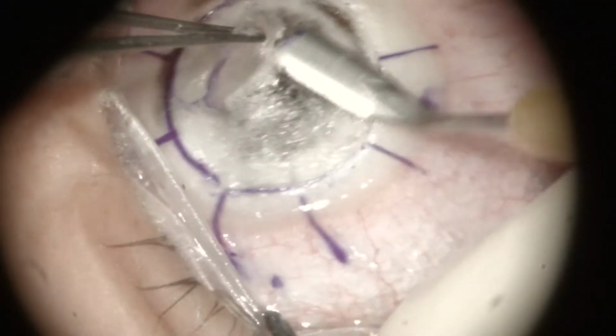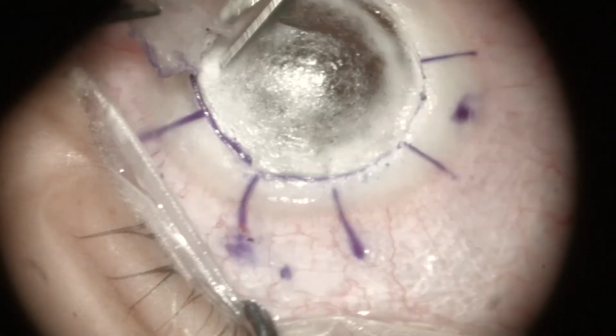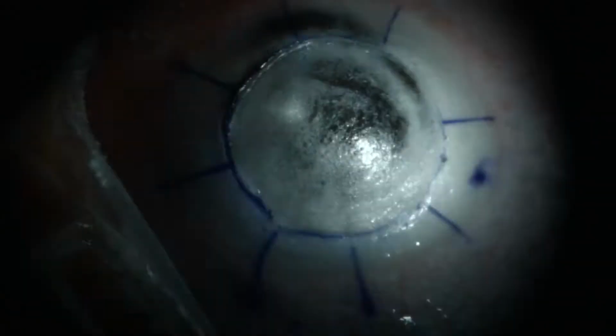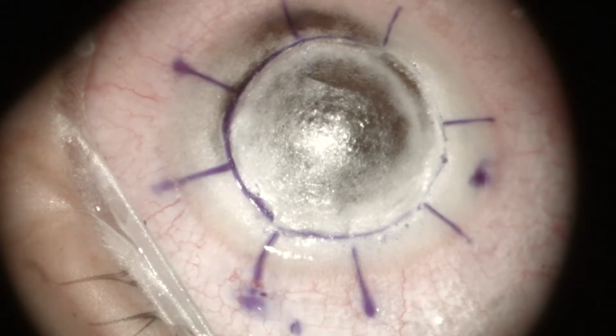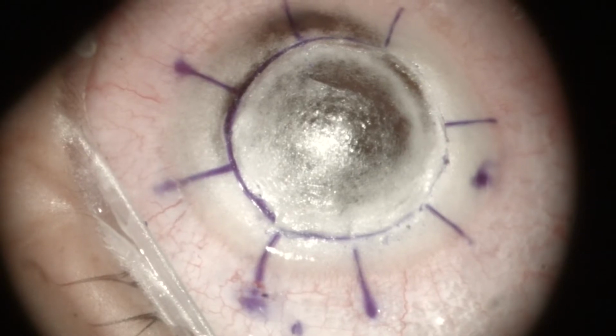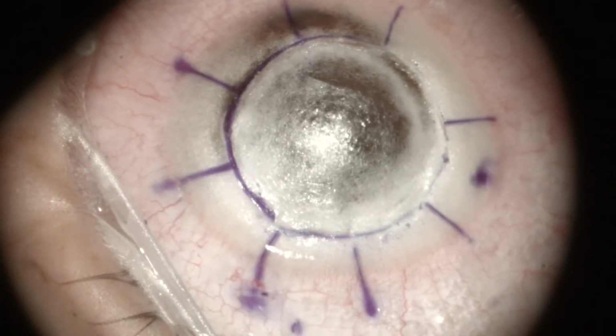Also, after a superficial keratectomy, knowing that the bubble is formed and present, to check for any air loss. This keratectomy allows us to easily remove the remnant stroma over the pre-Descemet layer once the bubble has been deroofed. Lastly, the transillumination helps us when the bubble is small and we need to expand it.